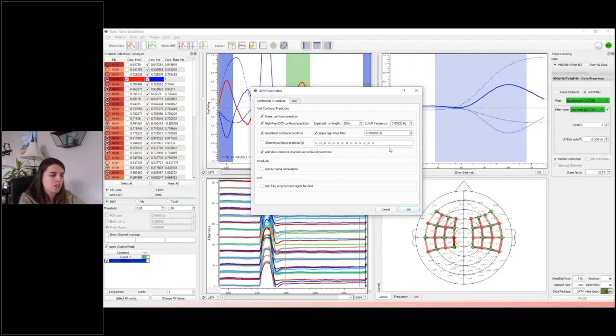Again, I just encourage you, if you have specific questions, please send them in the question and answer box, and we'll be sure they're answered. But right now, we're just going to focus on this specific pipeline.